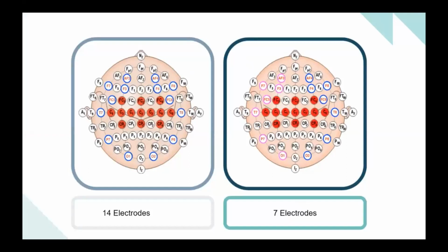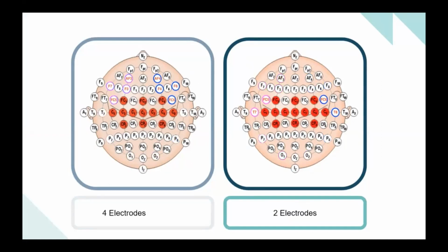At first, we tested with 14 electrodes as shown in the image on the left, and the resulting accuracy was 86.40%. Here, no scouting was implemented as we've used all our electrodes. Then we've experimented with 7 electrodes, and their locations are as shown on the right, and the resulting accuracy was 82.14%. Here you can see the problem with 14 electrodes, that we are still using electrodes far away from the motor cortex and have no use to us in motor detection, and with the 7 electrodes it's the same.